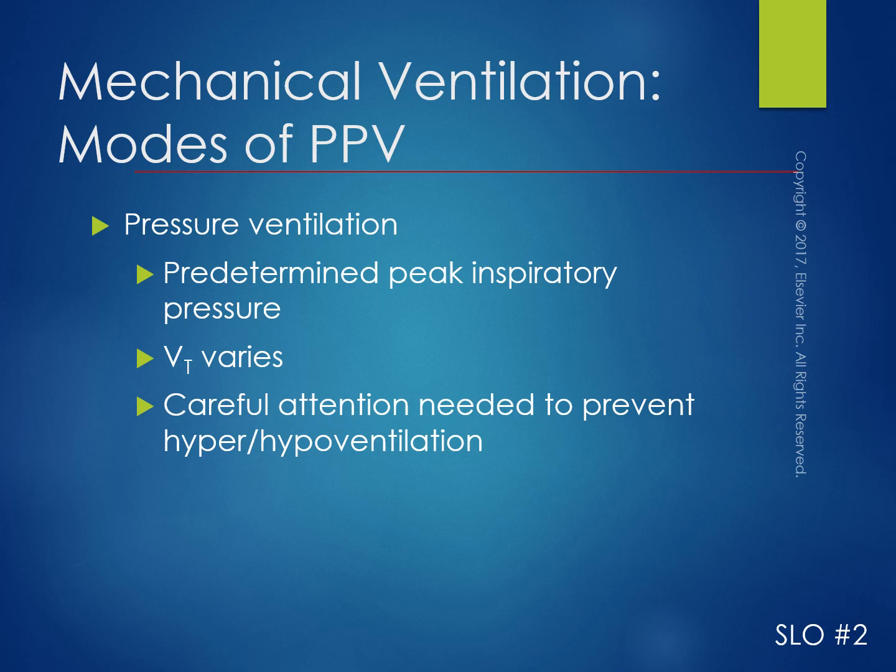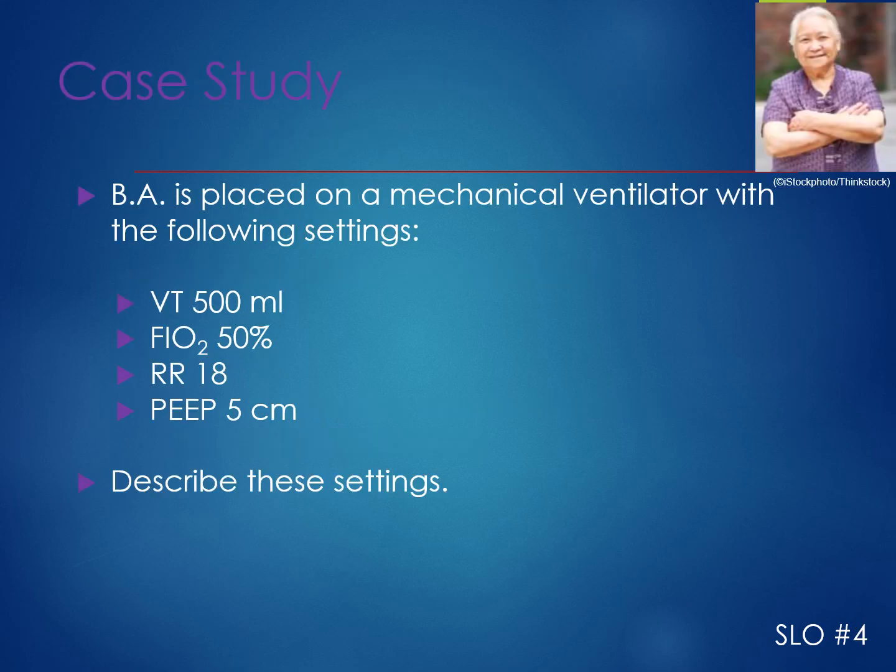situation, if you're trying to breathe against something that's trying to push air into you, that pressure is going to be reached very quickly, and then the volume of gas that's delivered is going to be small, if any. So it's really important that we make sure, we call that bucking the vent or ventilator asynchrony. So we really want to make sure that we're monitoring the patient and monitoring their ABGs and their SaO2 and the ventilator itself to make sure that they are not being hypo or hyperventilated.